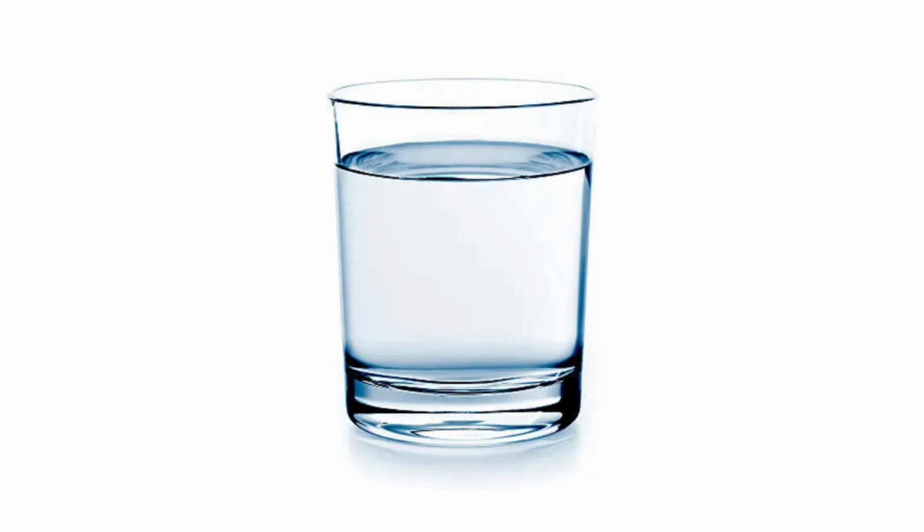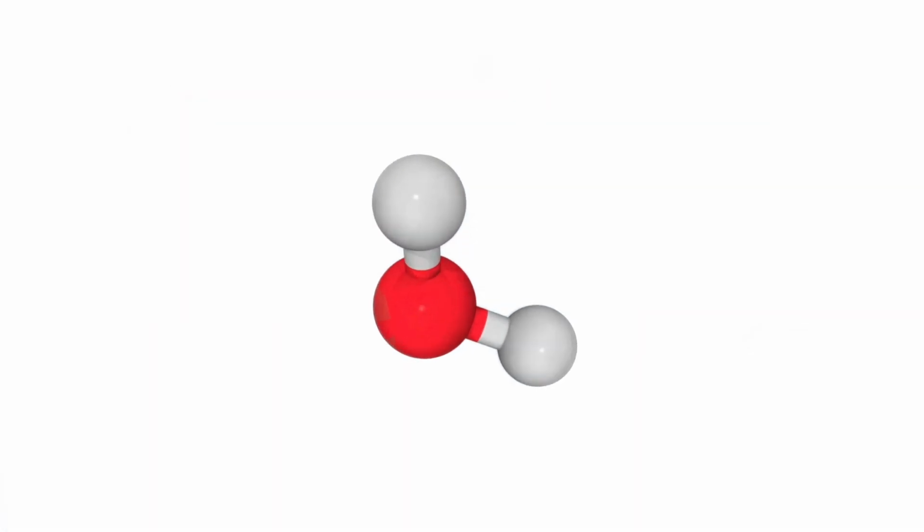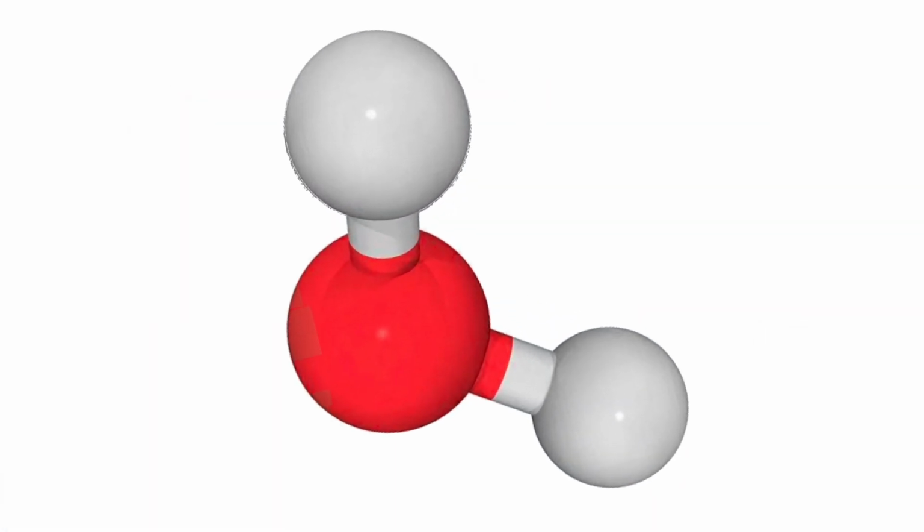Here we have a glass of water, and if we zoom in, we see that water is actually just a bunch of molecules. H2O, 2 hydrogen and 1 oxygen makes up 1 molecule of water. We're going to isolate just one of these molecules. The red sphere represents the oxygen, and the white spheres represent the hydrogen. And we're going to zoom into just one hydrogen atom now.